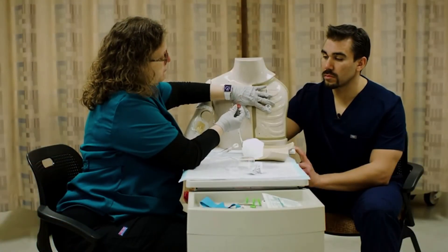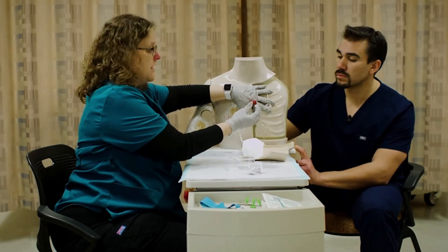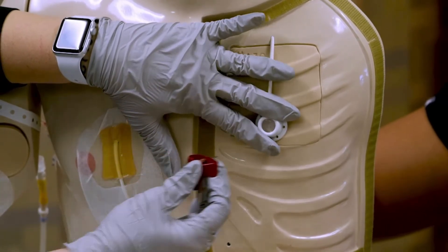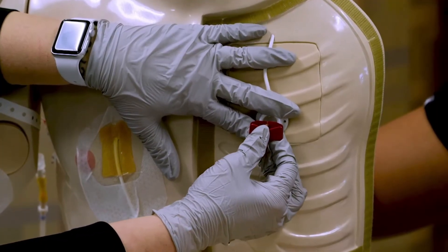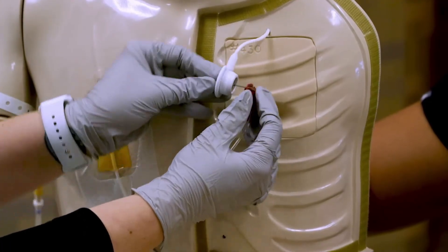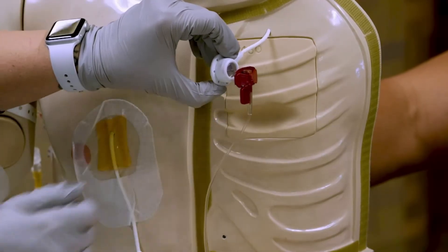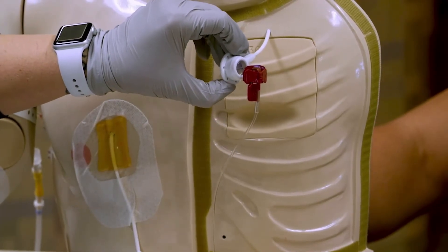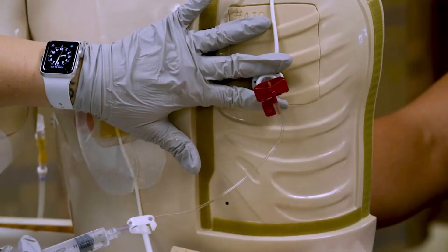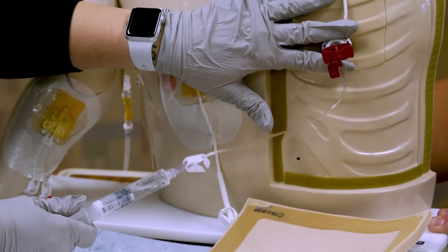Now I'm going to stabilize my port and stick right in the center. You ask how can you tell what the center is — well, I've cleaned it and now I have a sterile hand, so I can go back and feel that again if I really have to. I'm going to stick right between my fingers. With the subcutaneous tissue in between, that's actually going to lay flush against the skin. With that stabilized, I'm going to check and see if I can get a blood return, and I should be able to if it's in the correct spot.